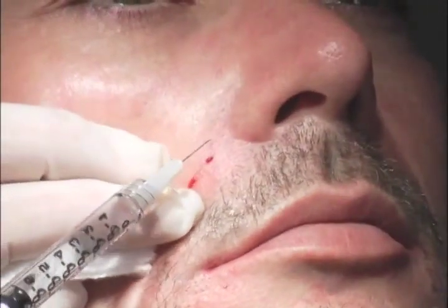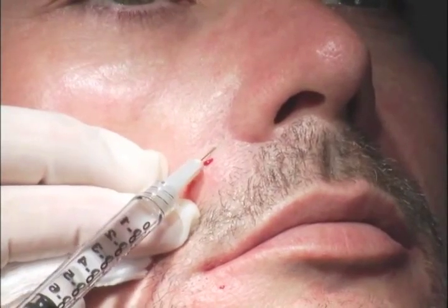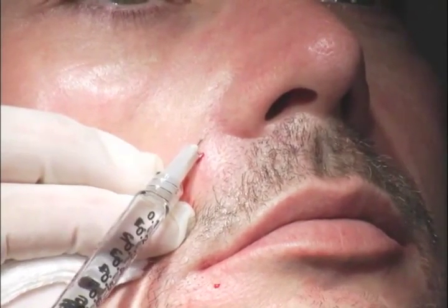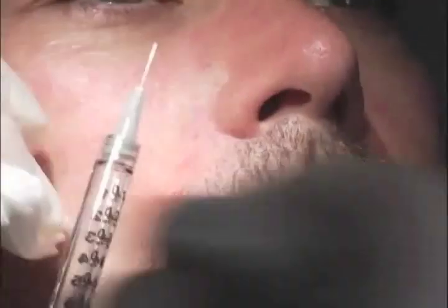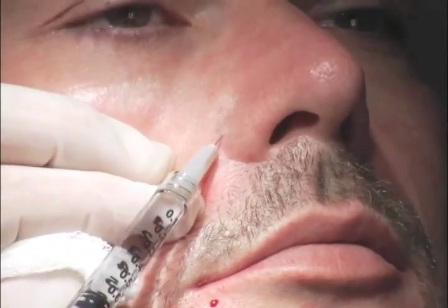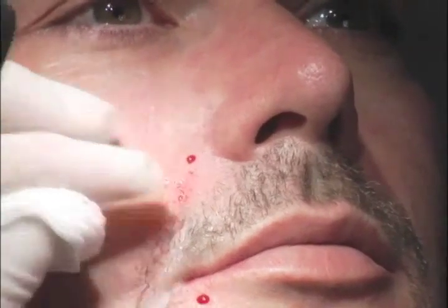What we're going to do is flatten that out by even going above it. And you'll see this hurt a little bit because we're going to go very close to the nose, which is a very sensitive area, and we're going to go right up here. See that? And what we're doing is flattening the space, okay, right around his nose. Bear with me. And by doing that, you also pull up the corner of the mouth.